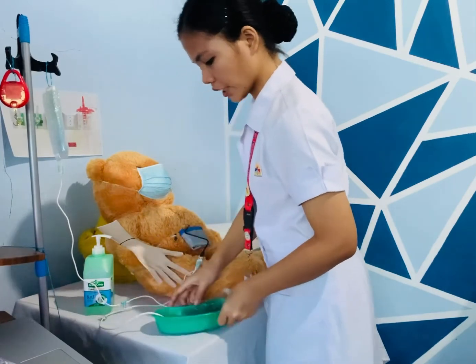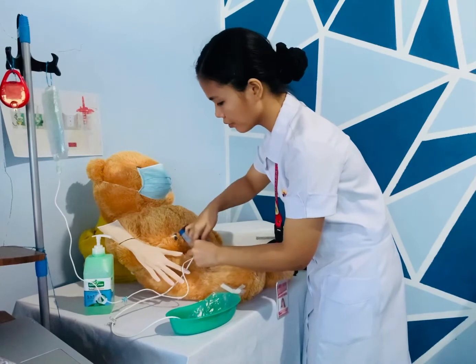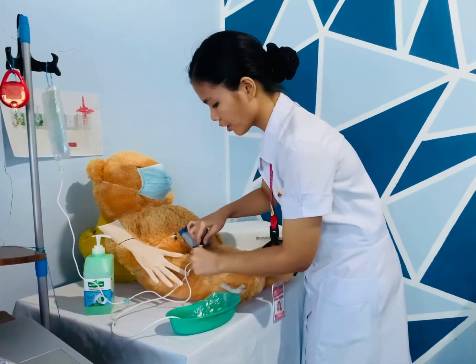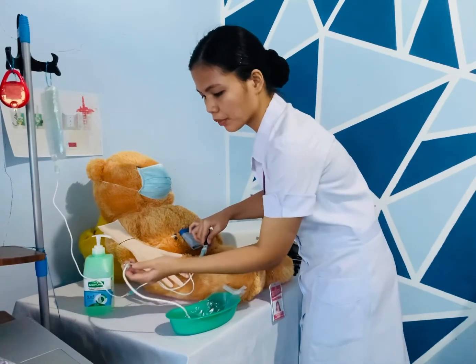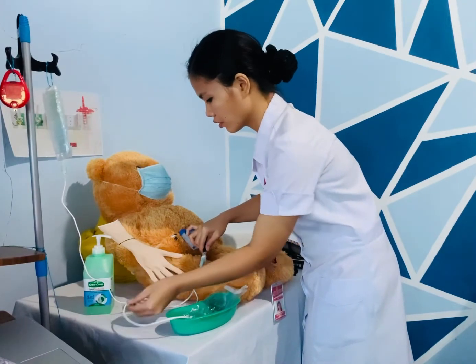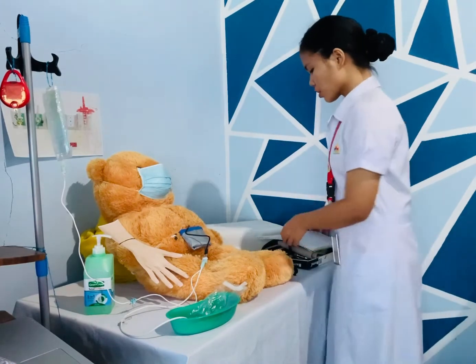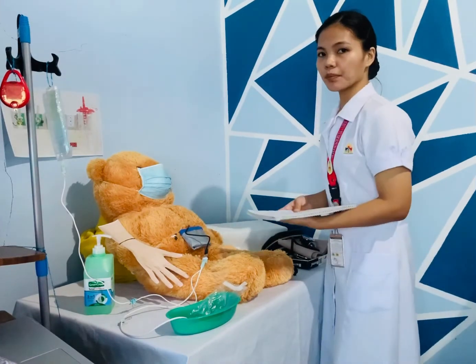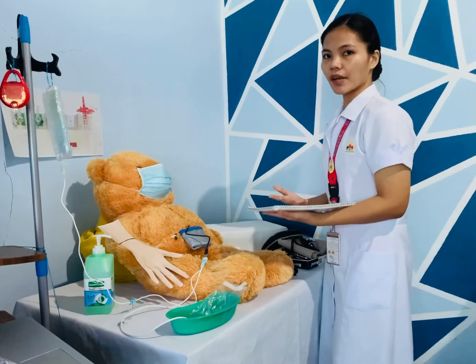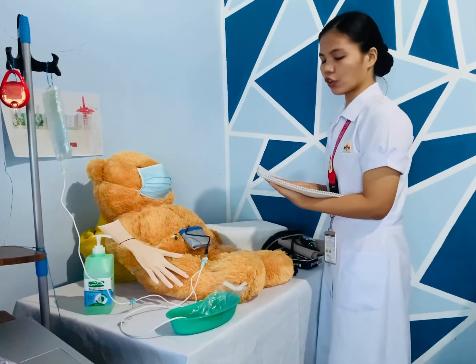So for the draining, open the twist clamp on the transfer set. Okay. Then open the white clamp on the drain line. So draining takes 20 minutes to complete. So while draining is taking place, record the time and percentage of the dialysis solution sa ating record book.